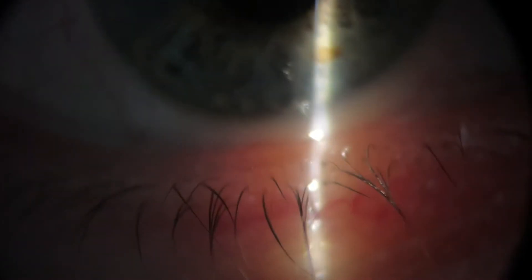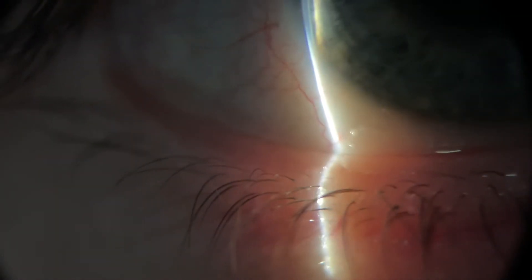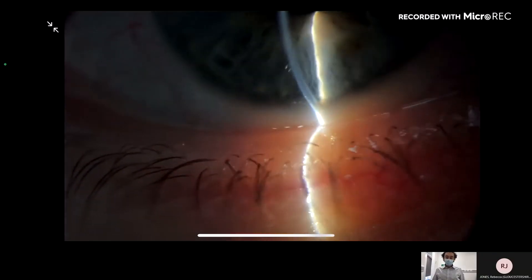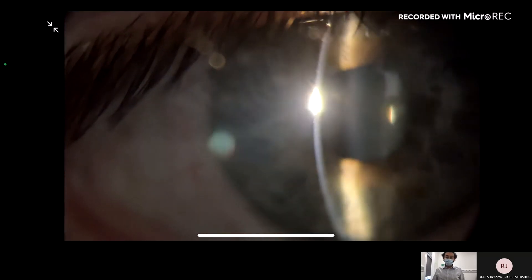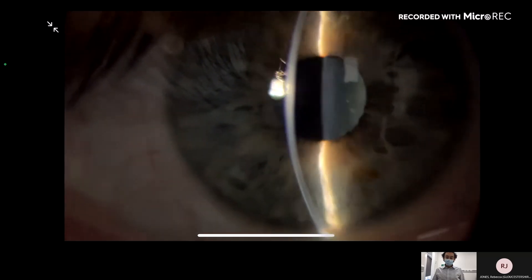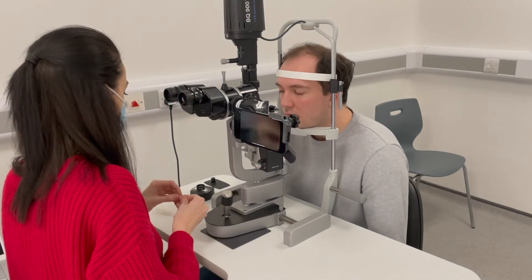Well, let's have a look at the cornea and the lids and the lashes and see what's going on. Oh, he does have a bit of blepharitis there. Cornea looks nice and clear. I suppose we might need to put some fluorescein in and just check that. Okay, let me just pop some fluorescein in then.